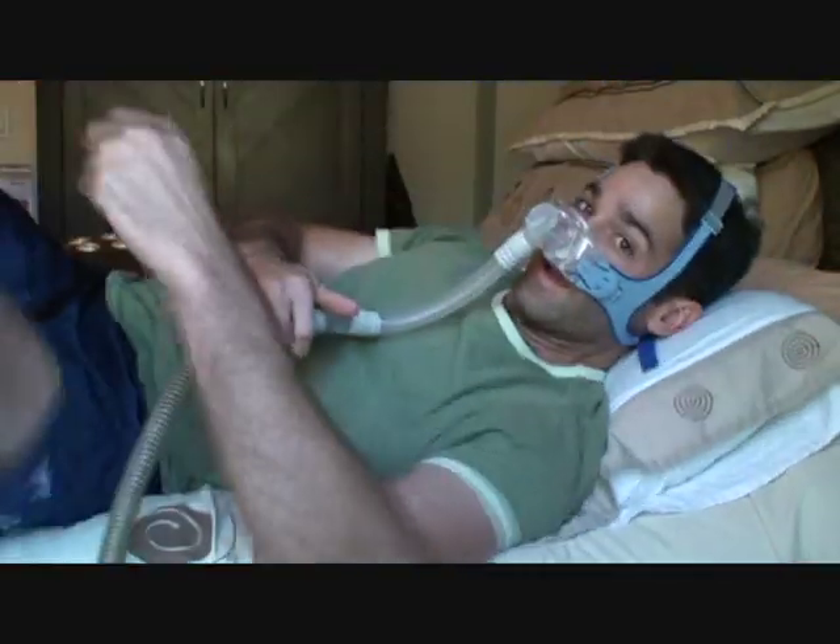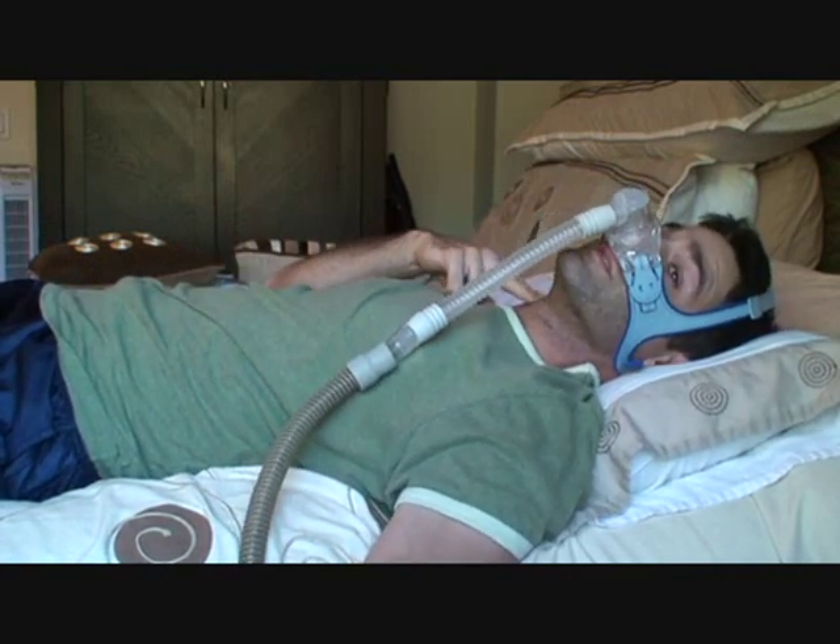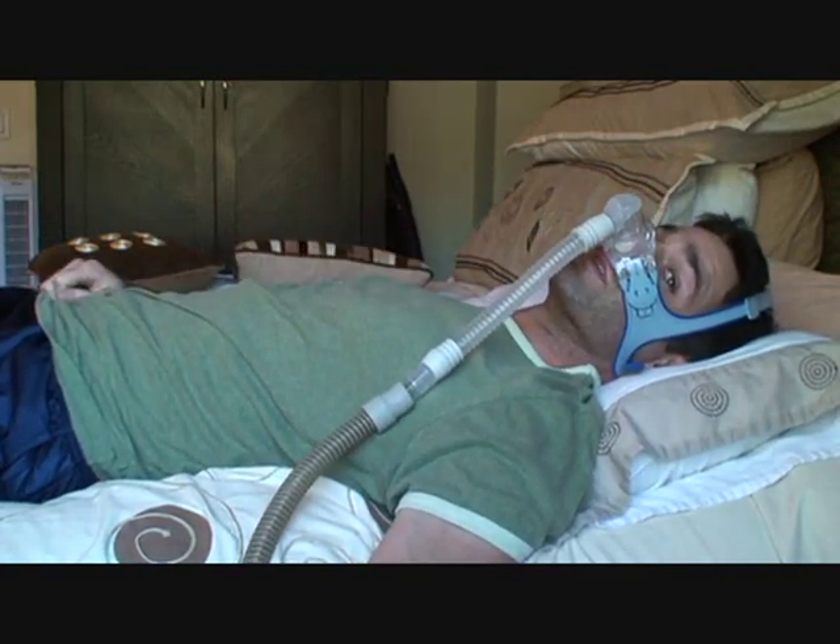First, you've got to have your CPAP mask on. When you're laying down in the neutral position — meaning your head and body are at the same angle — the air is able to enter the esophagus and go into the stomach very easily.